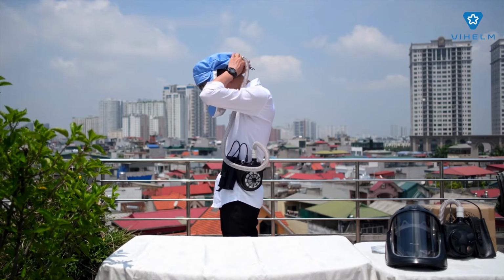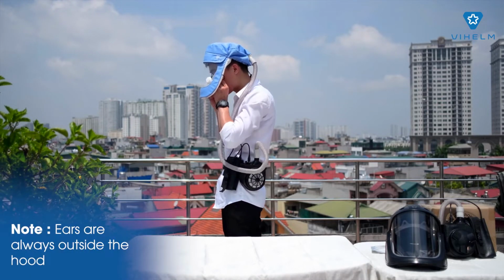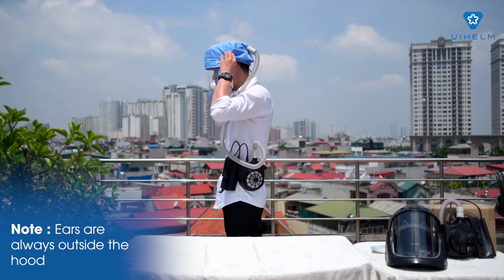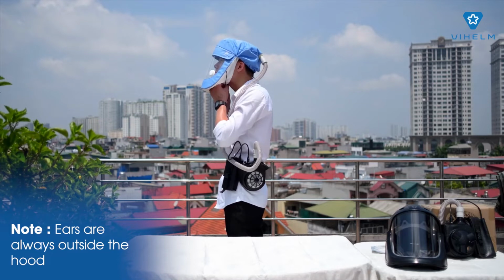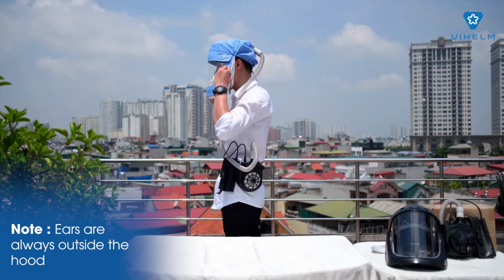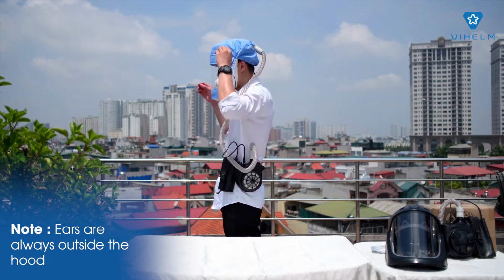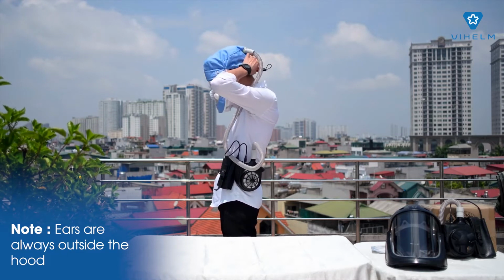The forehead pad should firmly stay on your forehead. Pull the drawstring on the back of your head to fit the hood around the head. Put your chin inside the hood. Pull the chin drawstring to fit the hood around the chin. If the Vihood is pushed forward, pull on the neck drawstring more tightly and place both hands on the sides of the hat and push the whole hat to the back for maximum visibility.